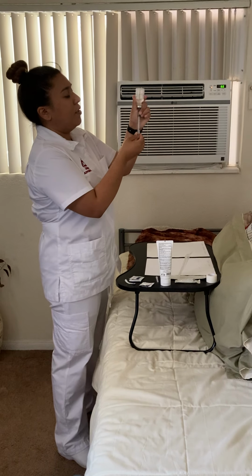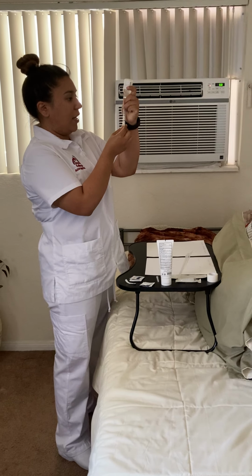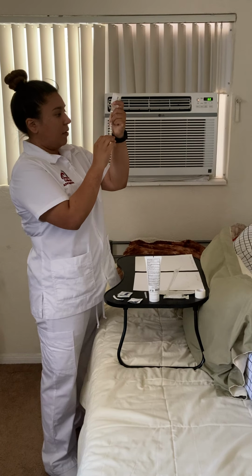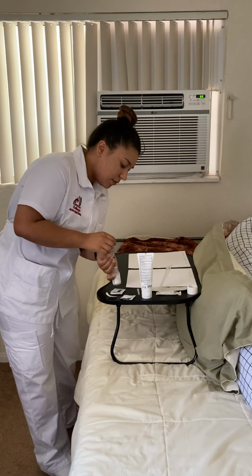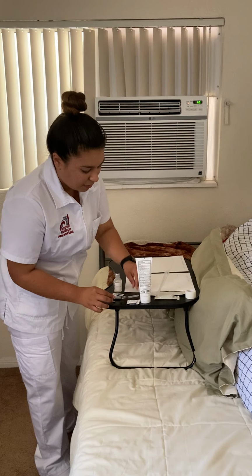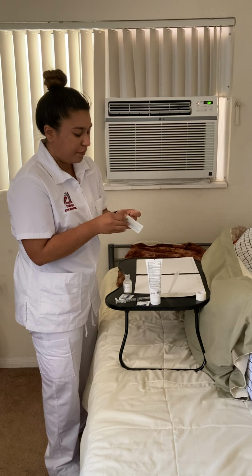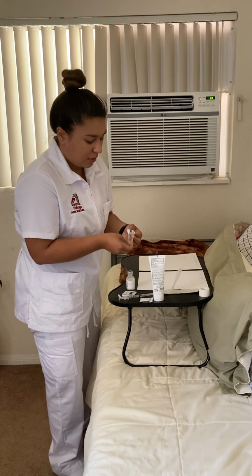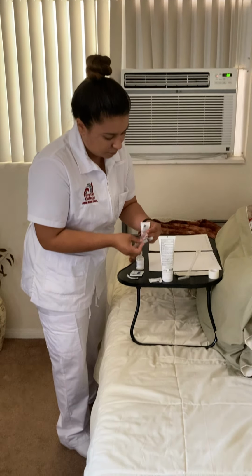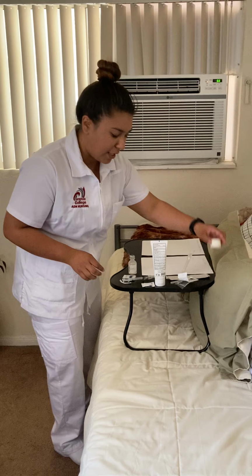And I'm going to put the window facing myself. And I'm going to get rid of any air bubbles. Okay. I'm going to go ahead and recap the needle using the scoop technique so that I can switch out the needle. So now that that's ready, I'm going to go ahead and create a medication label.